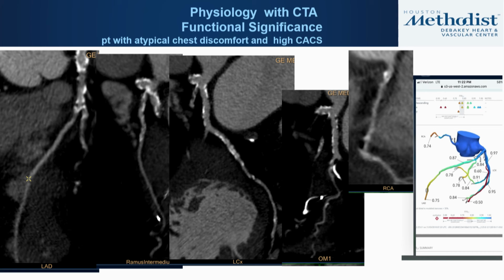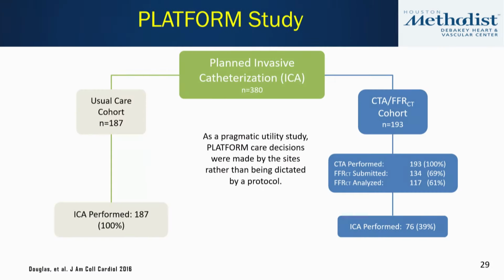And as you can see here, the patient has mostly eccentric calcification, and basically the only vessel that is quoted to be significant by CT-FFR is one of the branches at OM. But you can see that there's no significant stenosis in the left main, no significant stenosis at LAD, which for clinical management of someone who's 90 years old is good enough. The patient doesn't need any revascularization. All you have to do is intensive medical therapy. Okay.